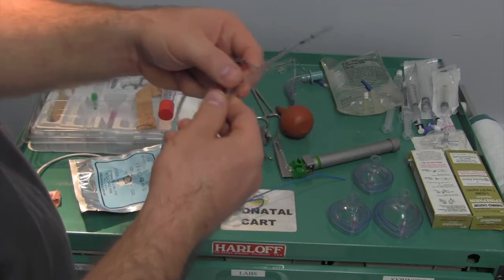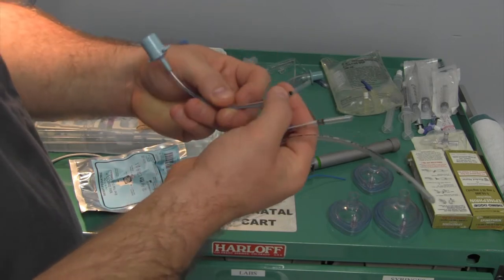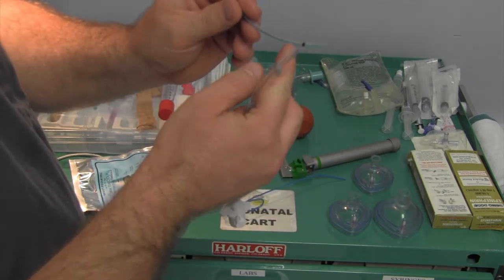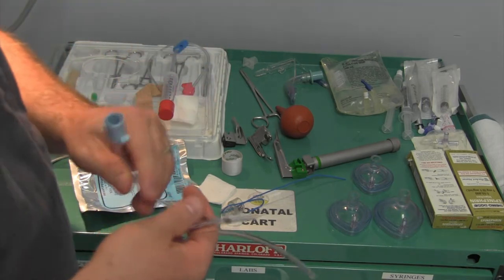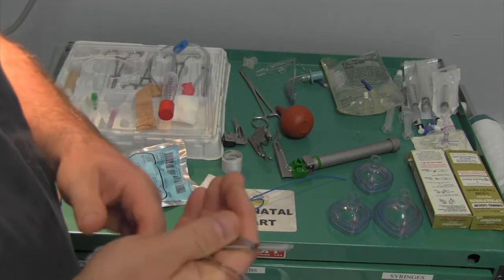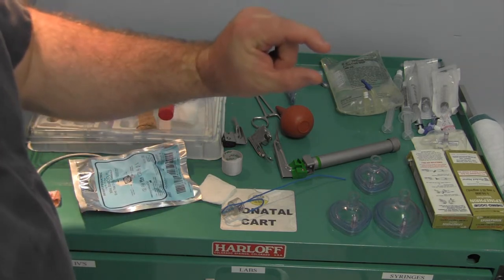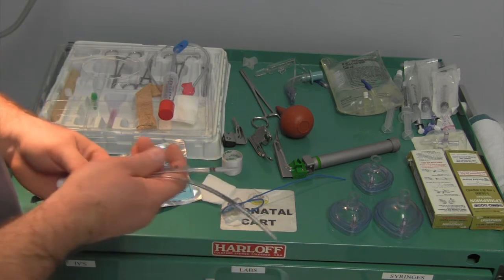The lines on the tube are vocal cord lines - how we use them. You just put these just barely past the vocal cords and you know you're in the right spot. Generically on chest x-ray we're looking below the clavicles and above the carina. But on even a term neonate, it's only a space about that big, so you're not dealing with that much space.